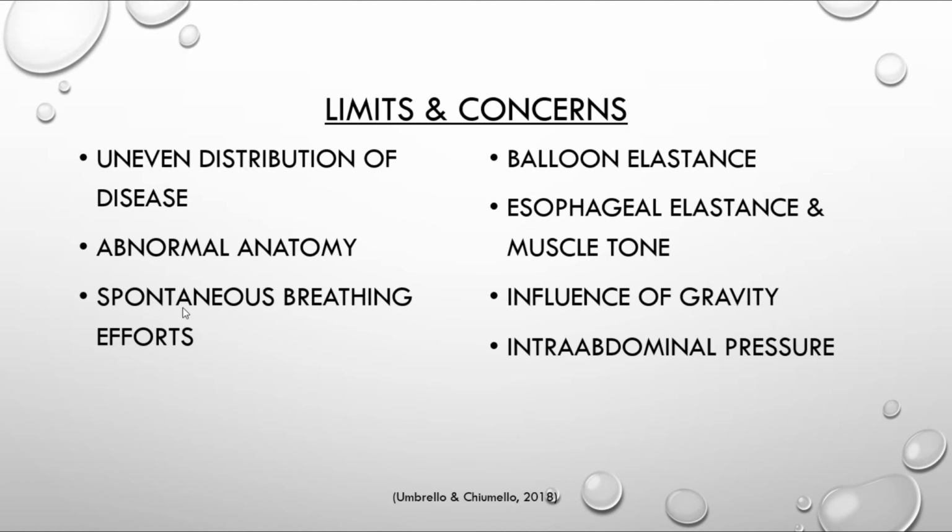Spontaneous breathing efforts are what we want to avoid when we're trying to take our readings, because any patient effort is going to throw off our inspiratory hold or expiratory hold, and we're not going to get a very accurate reading at all. Other things are balloon elastance and properties of the esophagus, how gravity can affect our readings, and intra-abdominal pressure, like maybe an overdistended abdomen.